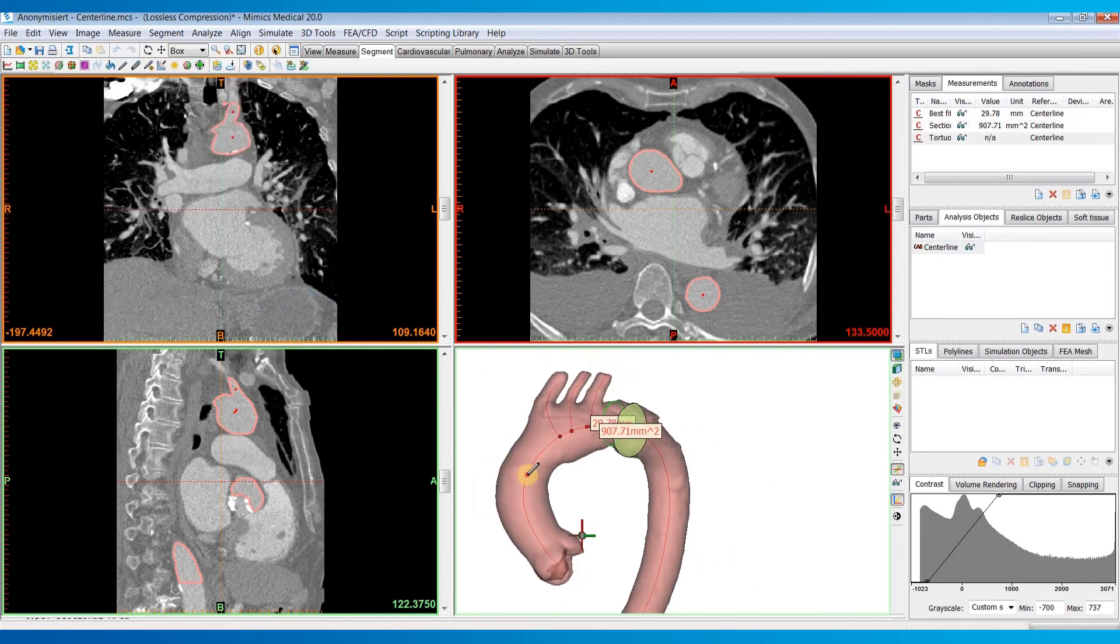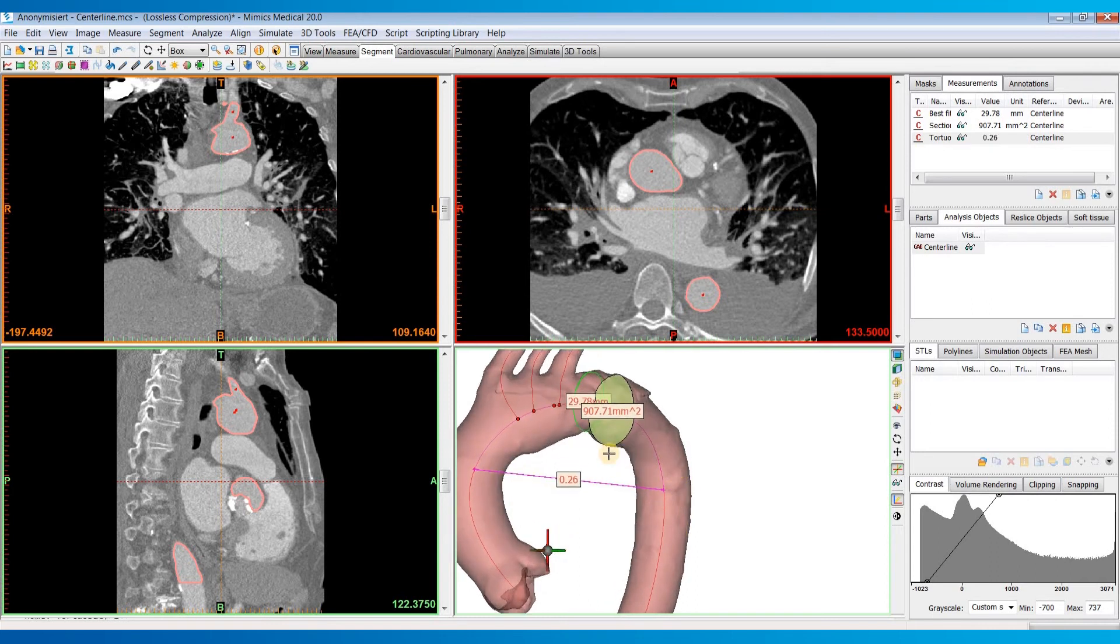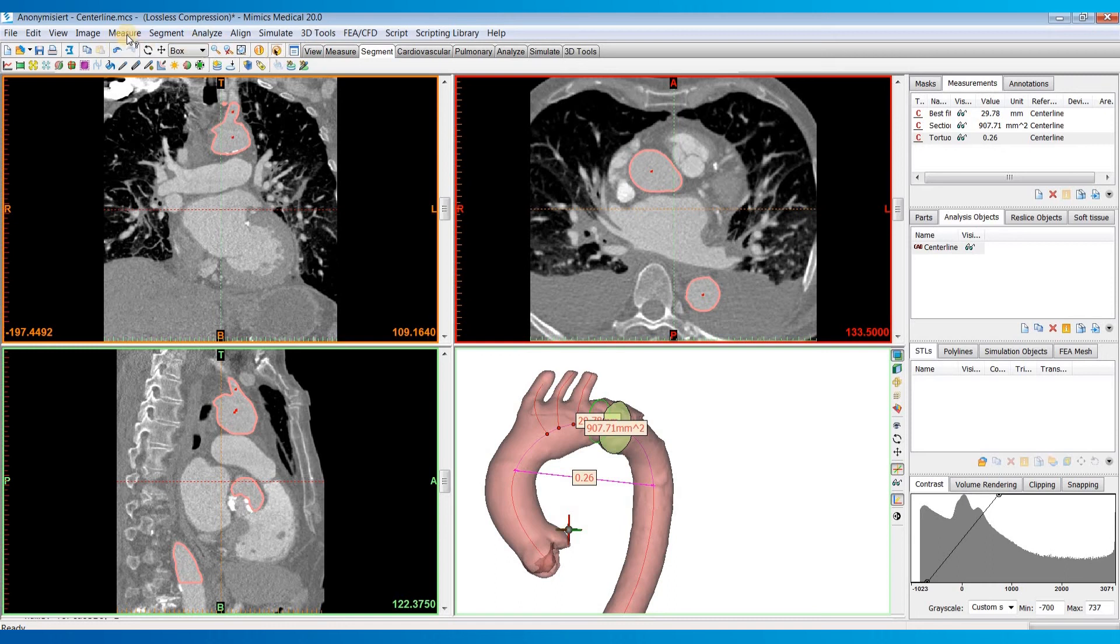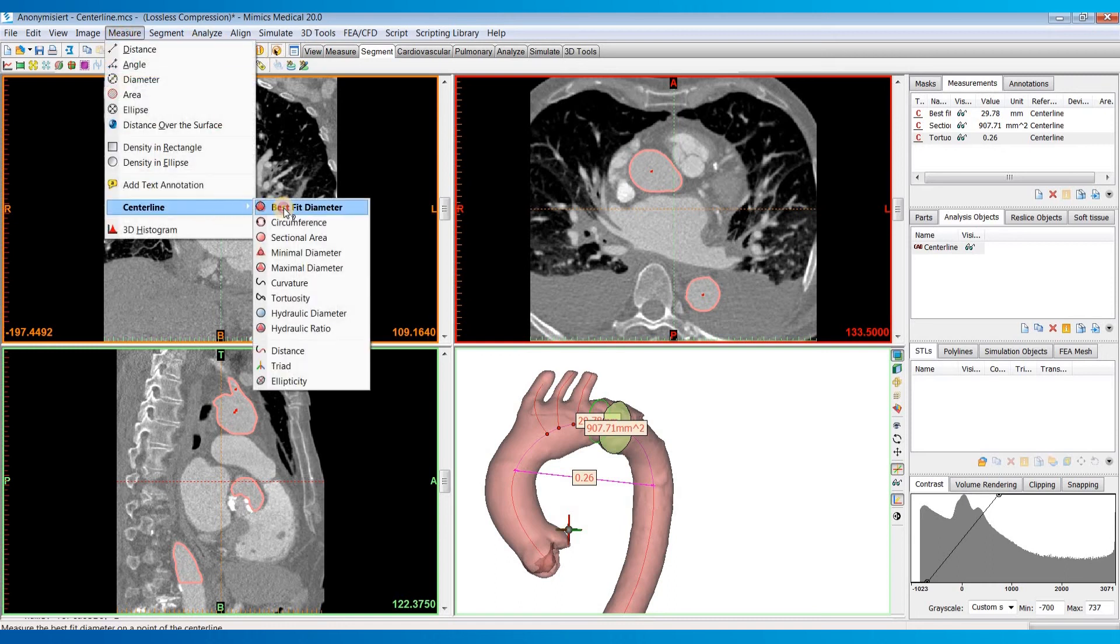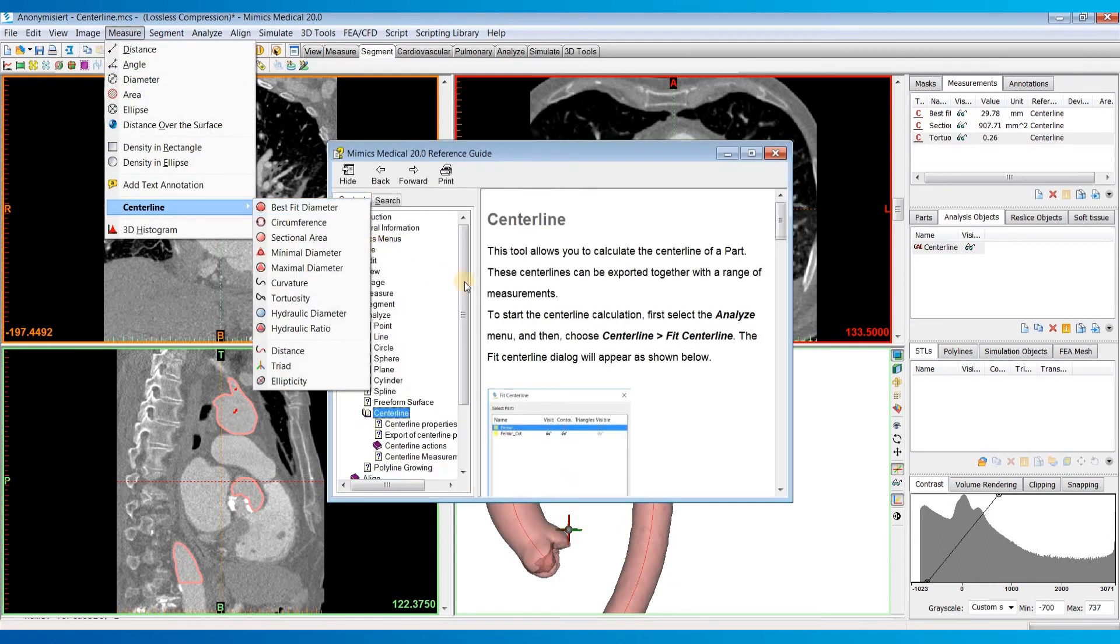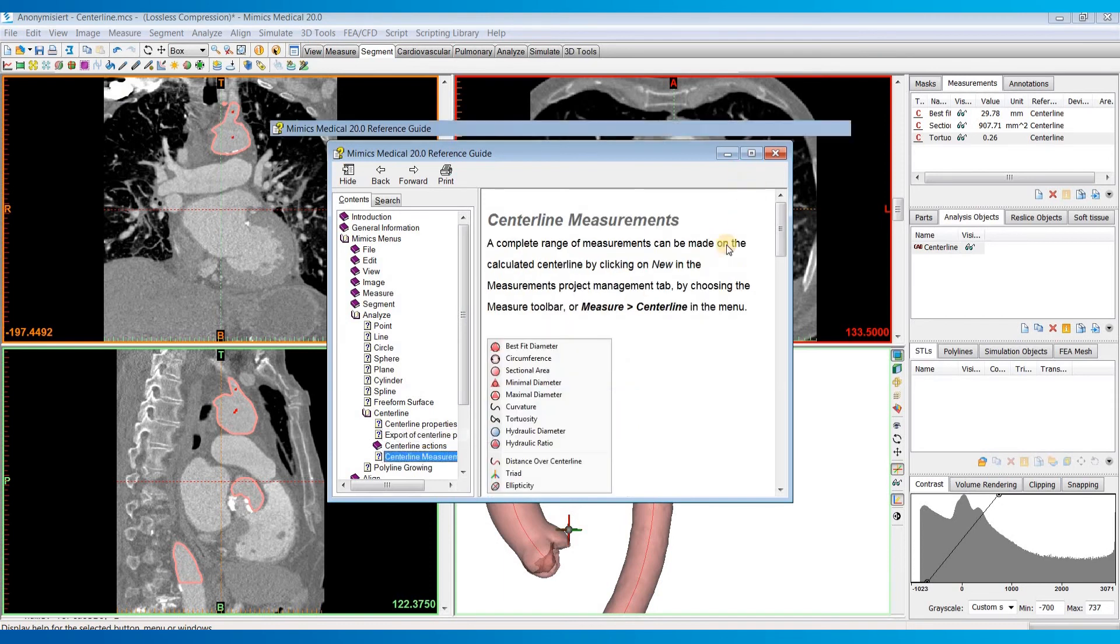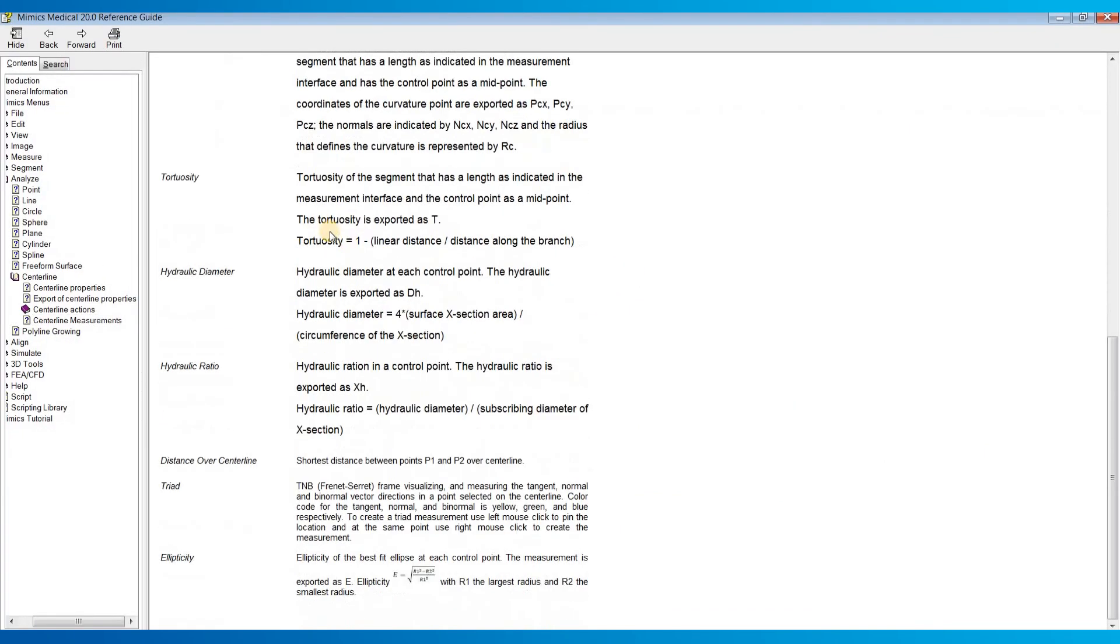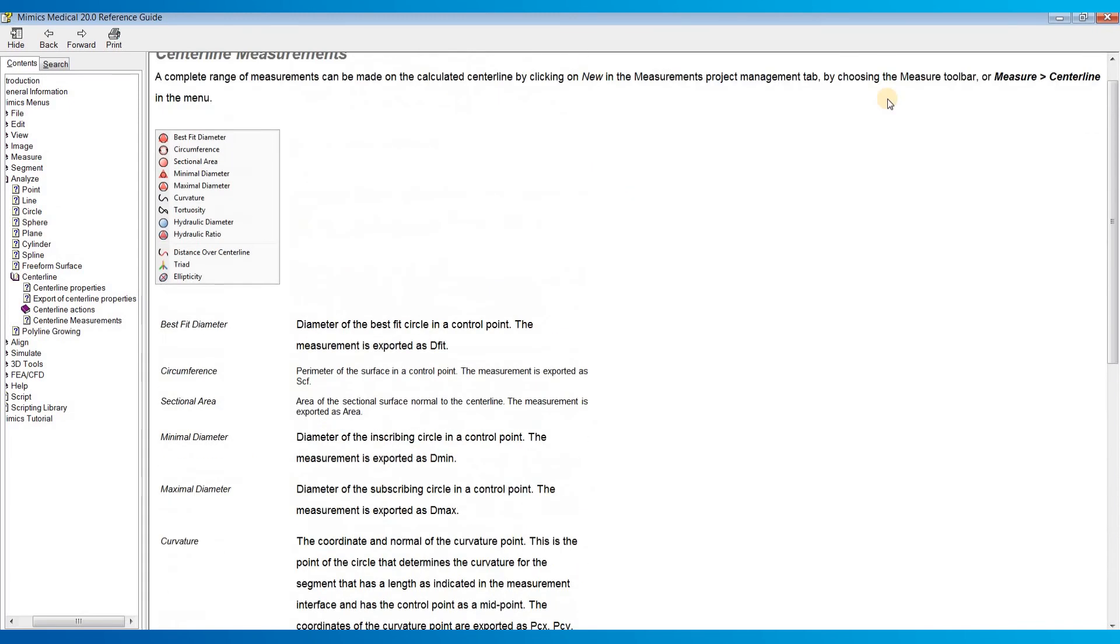You can also do measurements such as the tortuosity. So this works by clicking a start point and an end point. And it will measure the tortuosity between those two points. And if you ever wonder how it's calculating these, you can always click on this context help button right here. And then go to measure and click on the centerline tool. And then click on centerline measurements. And if we bring this up, you can see a description of each of these measurements and how they're calculated.